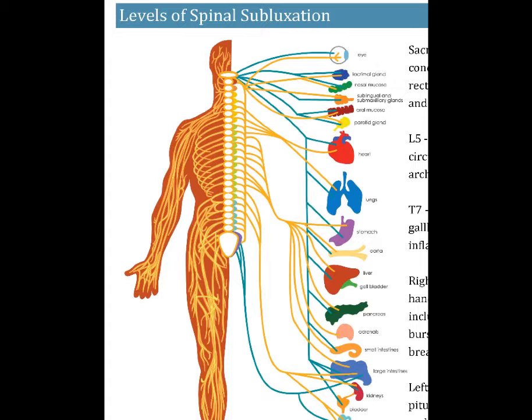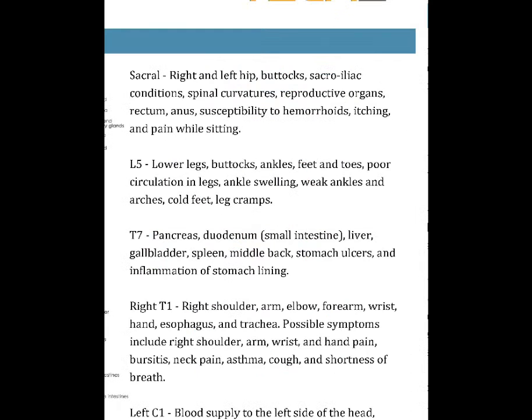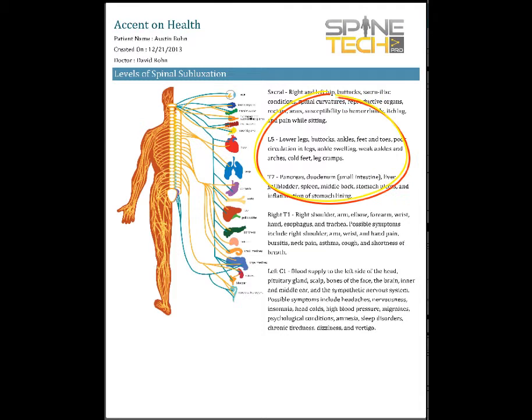It's just a thing. And I don't tell patients that we're going to resolve their reproductive organs or that it's causing hemorrhoids or any of those things. I just let them know that their nervous system is doing more than just pain. And so by printing this, if they have an L5 issue that you've talked about in the X-rays, you have an L5 issue. It's right here, and that nerve comes out, goes all the way down the leg. And you let them take this home.